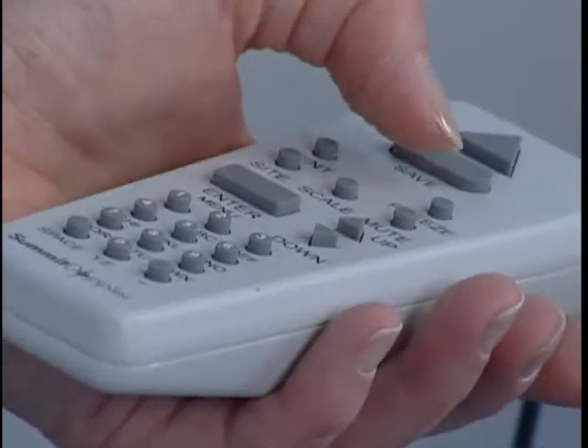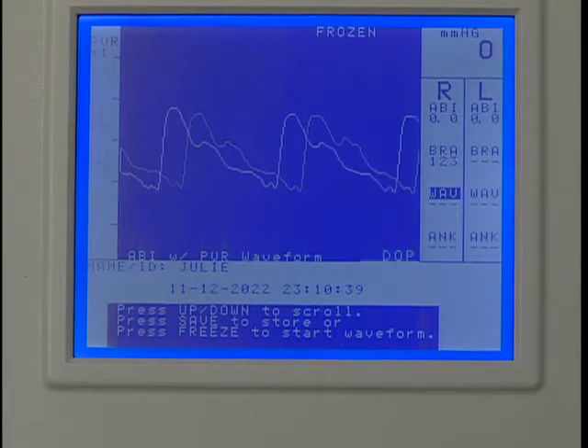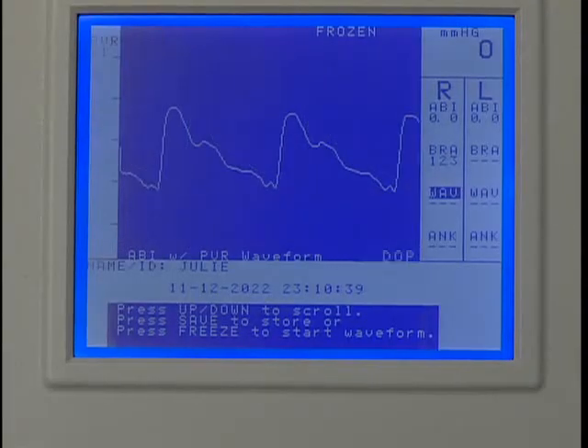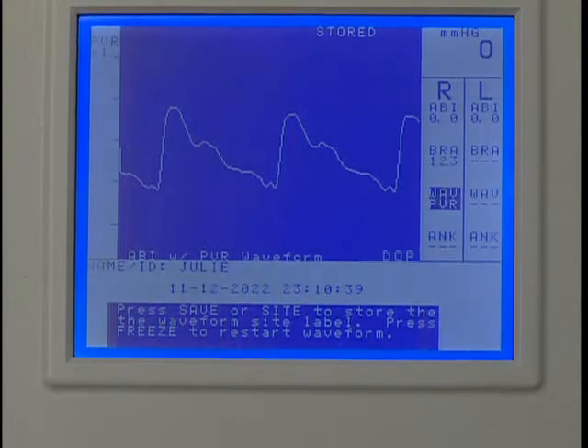After the waveform stabilizes, press Freeze. You have two options: if the waveform is acceptable, press Save to record it, or use the up or down key to scroll to the optimum waveform and then press Save to record it. Press Save again to move to the next protocol location.